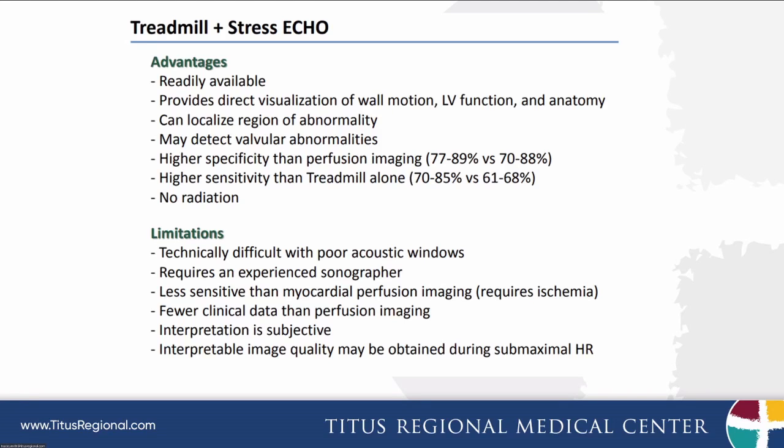The limitations are that not all patients are easy to image with echo machines, and it requires a very experienced echocardiographer to be able to image the patient within that 60 seconds while their heart is maximally stressed and their heart rate is still elevated.